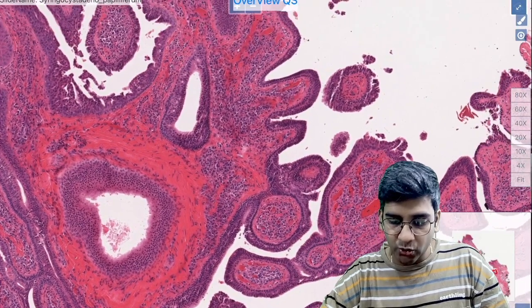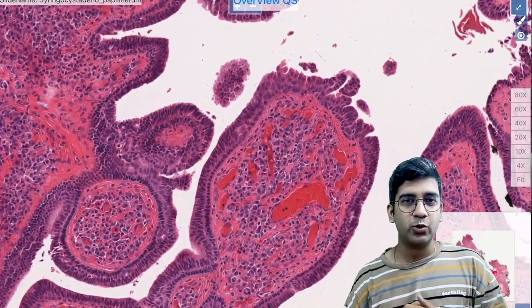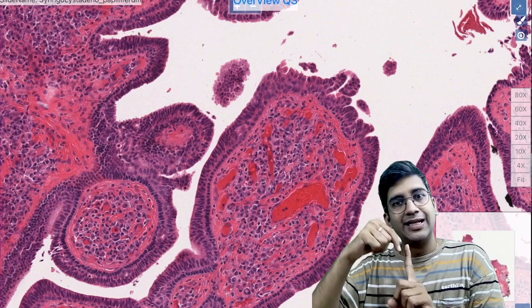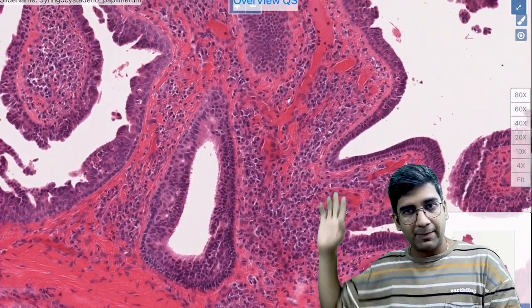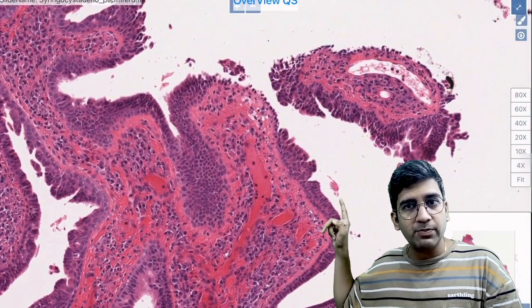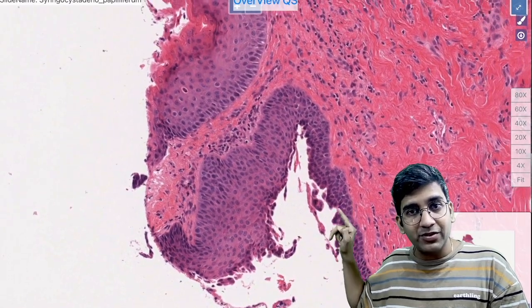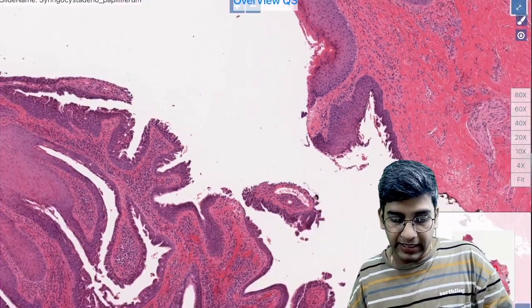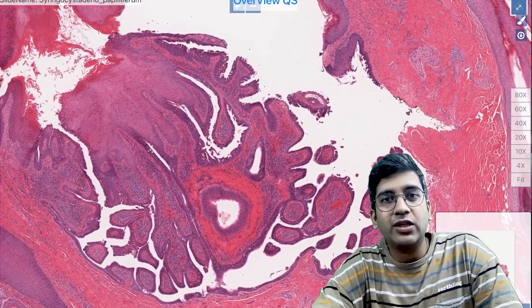We call it Syringocystadenoma papilliferum. It's papillae. You can see the cut surface. In the center you have a fibrovascular core. The main difference in how to identify a papilla on a cut surface is it'll have lots of vascularity like this, surrounded by an epithelial architecture. Or when it's a papillary form cut vertically also, you can see the vascularity here. Wherever you notice the papillae, you will have the double layering of epithelium. And like you can see, from the double layering epithelium, it'll obviously gradually transit into your squamous epithelium, right? That transition is what makes the entire structure unique, and it's not something you can miss on a diagnosis.